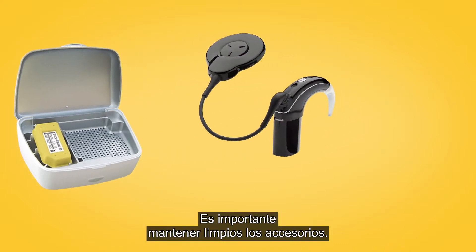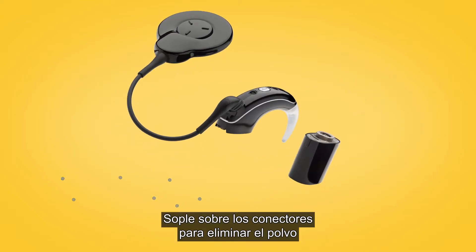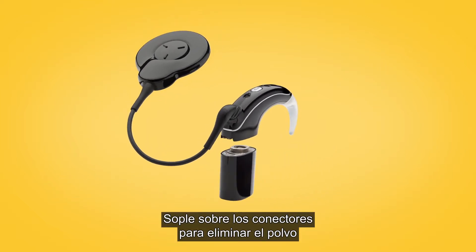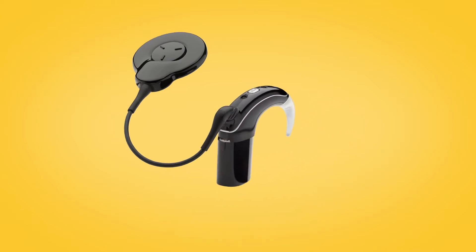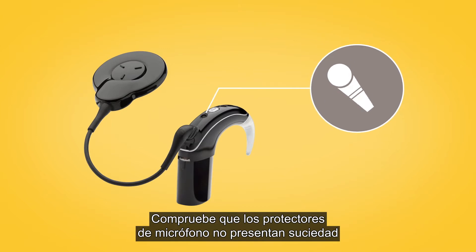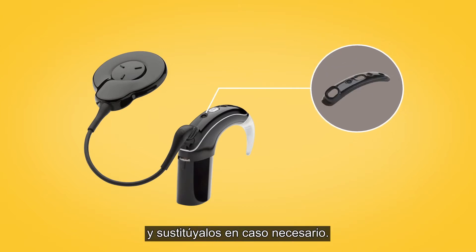It is important to keep accessories clean. Blow on connectors to remove any dust and clean accessories with a soft dry cloth. Check the microphone protectors for signs of dirt or grime and replace if needed.